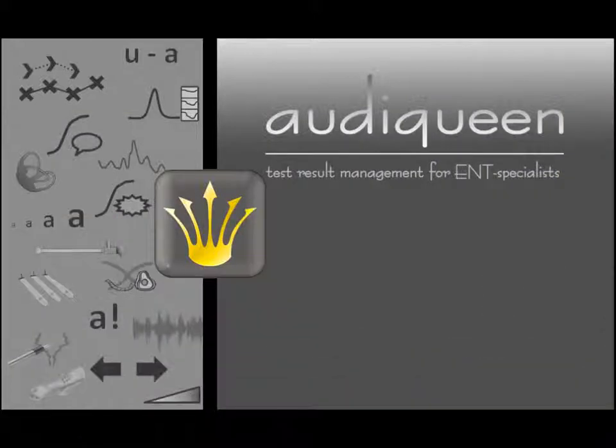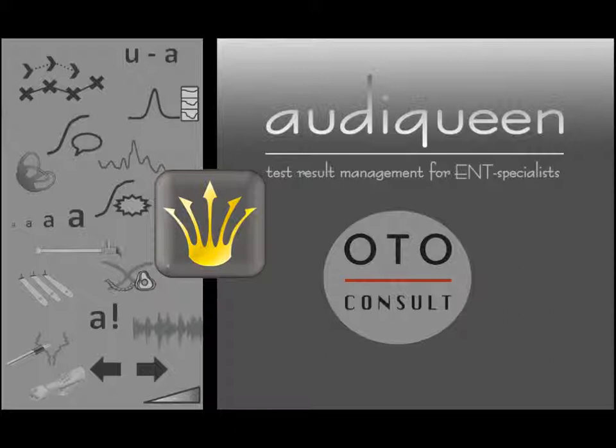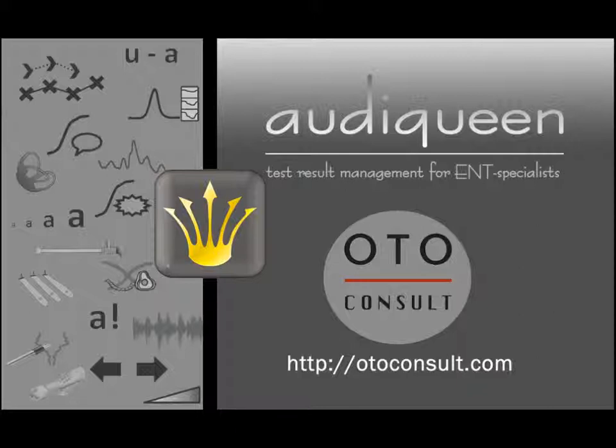These are the main features of Audiqueen. You will discover many other possibilities once you use the program, either as a standalone application or in conjunction with your electronic medical record. Audiqueen is a product by Otoconsult. Thank you for visiting our website. Do not hesitate to contact us for more information or assistance. We will be happy to receive any feedback from you, and we remain committed to creating the best solution to your needs.